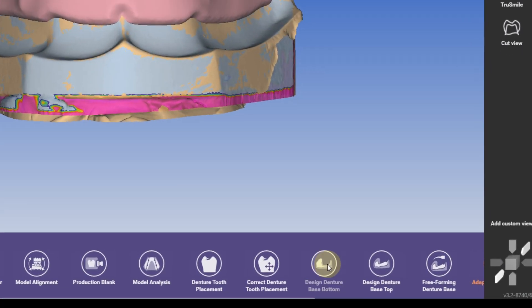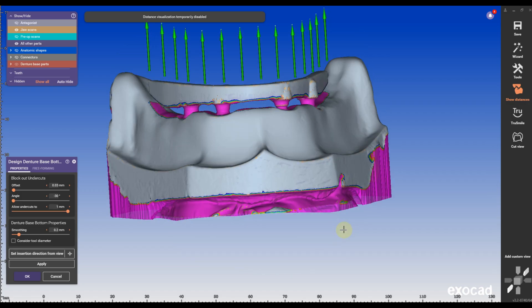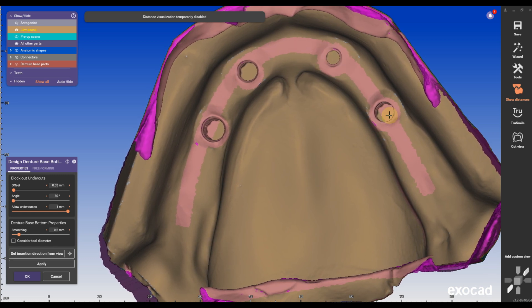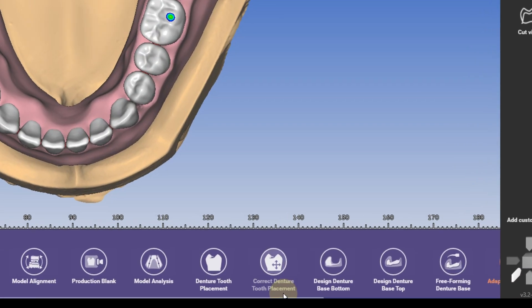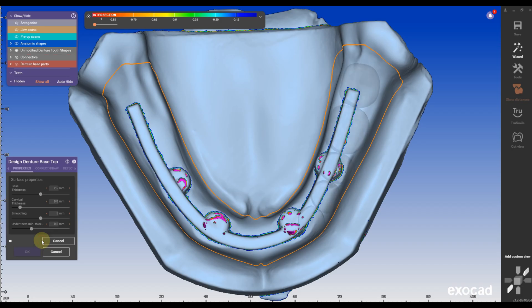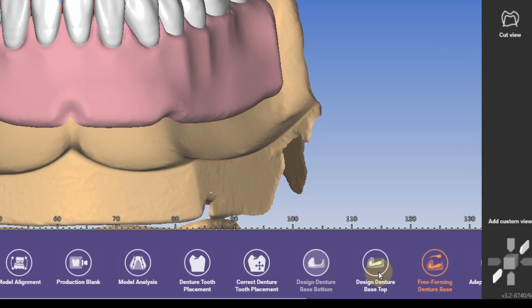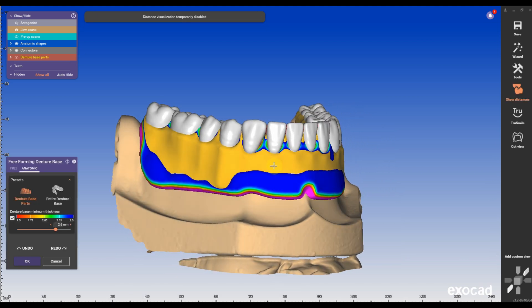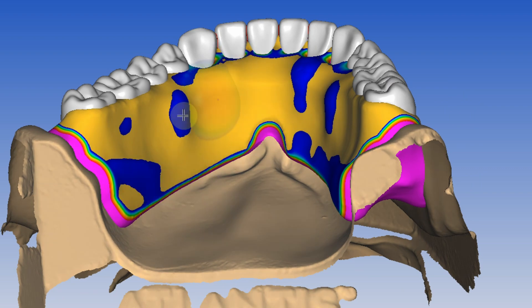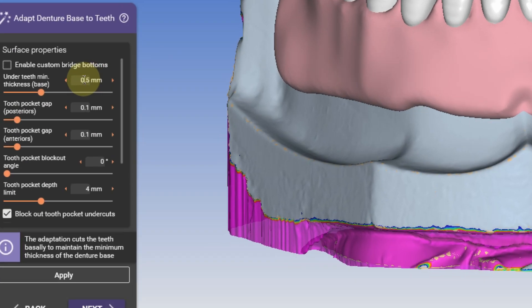Now we have a mesh with a bar in our design. We have to adjust the denture design bottom first because we still have the old one — make sure there are no intersections. That's why we imported the scanflex scan; otherwise, we will have bleed-through underneath. Adjust the denture bottom and click apply if you want to keep your old design. Now we can go into freeform denture and add and smooth any areas that we want, adding any materials to make the denture look nice.